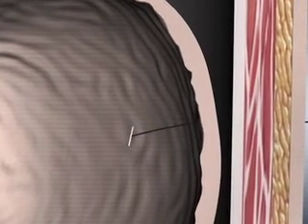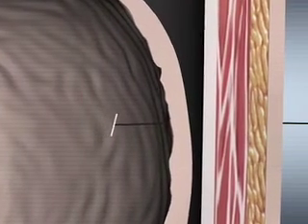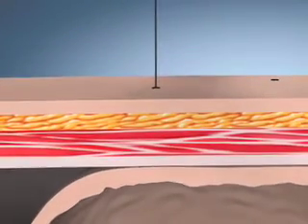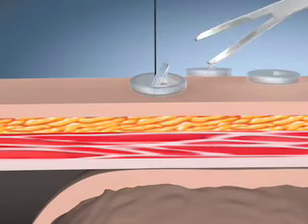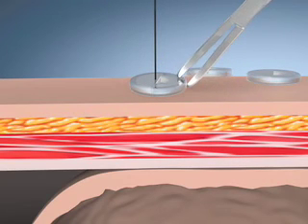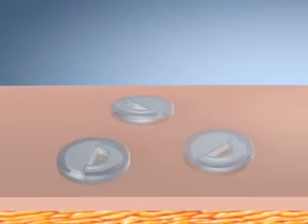Withdraw the needle while continuing to gently pull the T-bar until it is flushed against the gastric mucosa. Gently slide the suture lock down to the abdominal wall. Close the suture lock with the supplied hemostat until an audible click is heard, securing the suture. Repeat the procedure until all three devices have been inserted in the corners of the triangle.